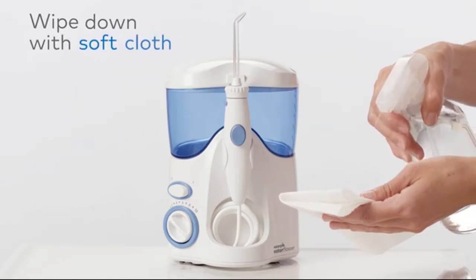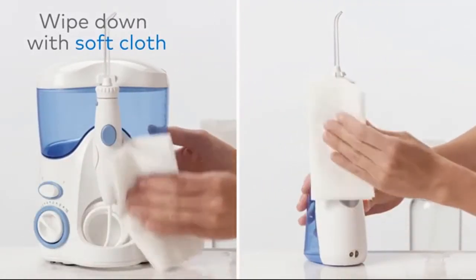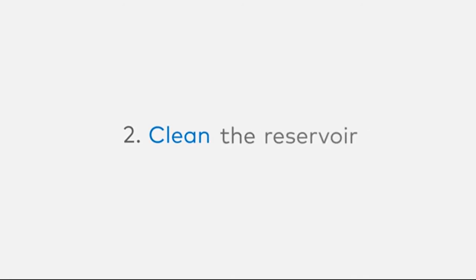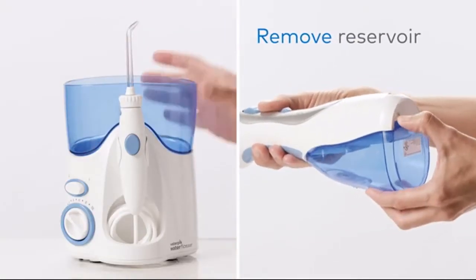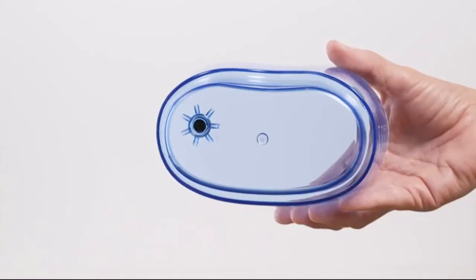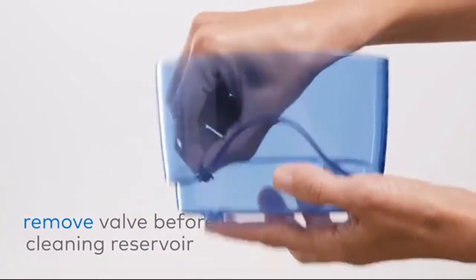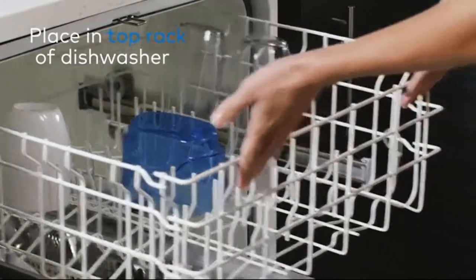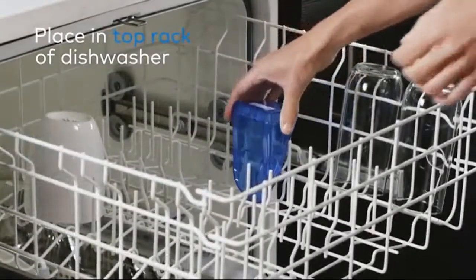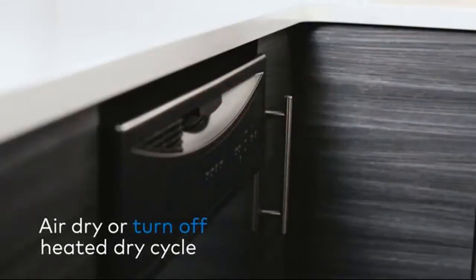Wipe down the outside of your water flosser with a soft cloth and non-abrasive cleanser. Tip number two: clean the water reservoir by removing it from the unit. If your reservoir has a black valve, remove the valve before cleaning. Place the reservoir in the top rack of the dishwasher, and make sure to air dry or turn off the heated dry cycle.